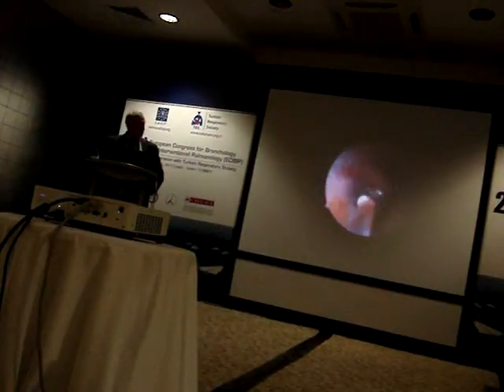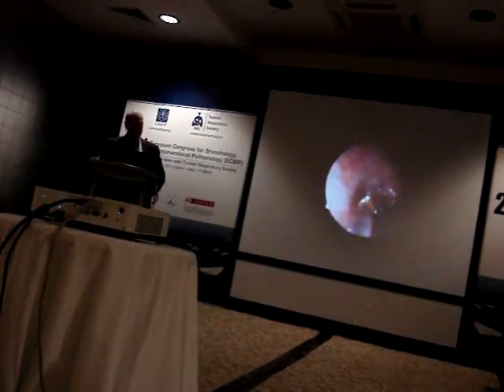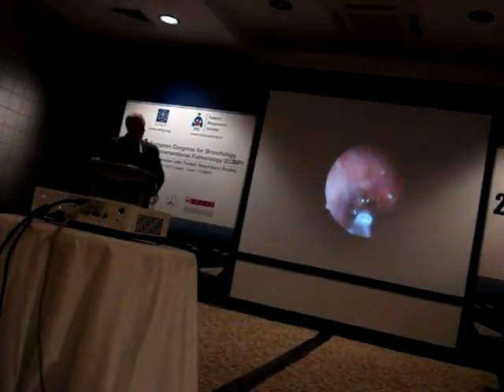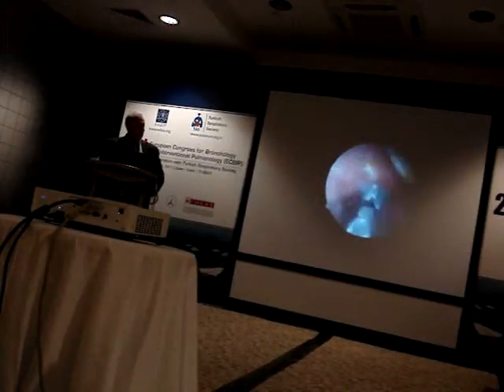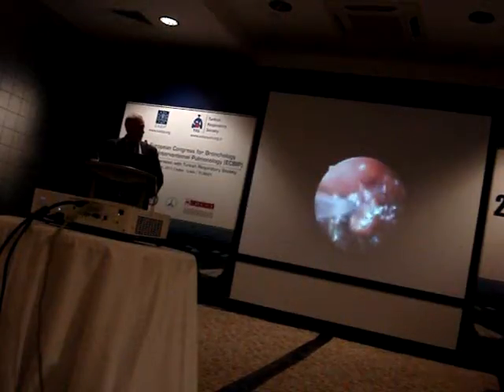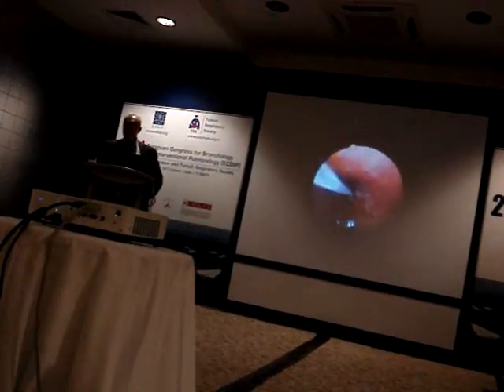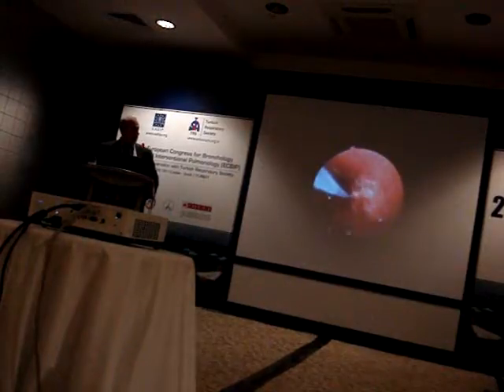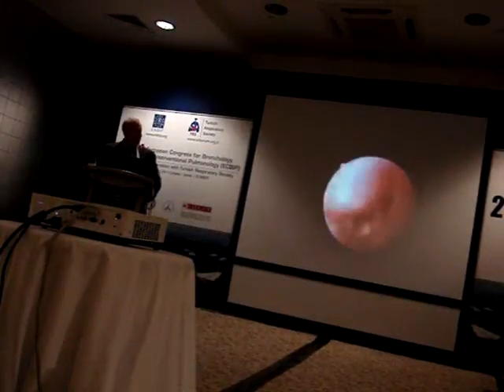We used the diode laser system, and step by step disintegrated the tumor. The surface of this tumor was bleeding. Now the patient is undergoing chemotherapy, and we planned stenting. This is hemostasis. We planned stenting, and we were prepared to wait.